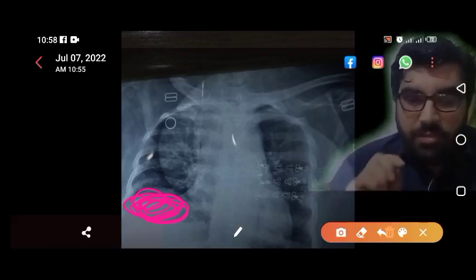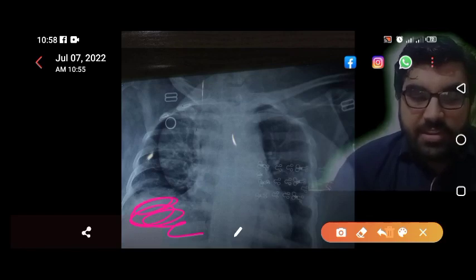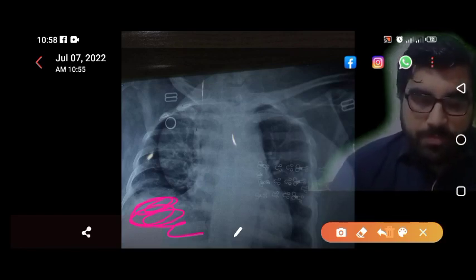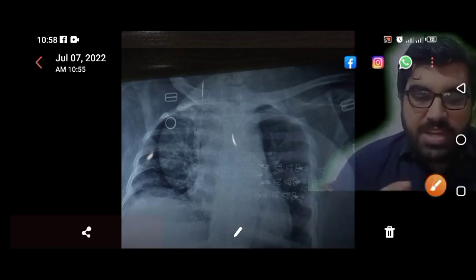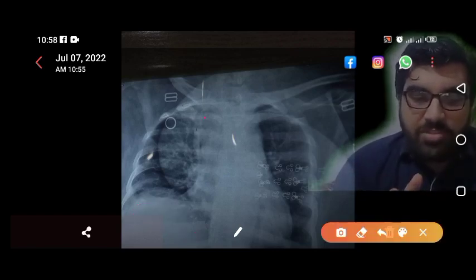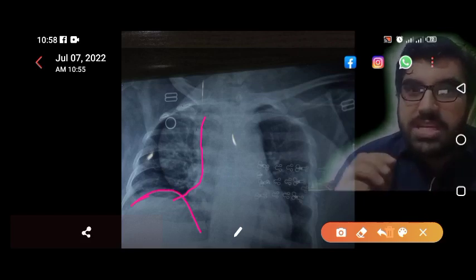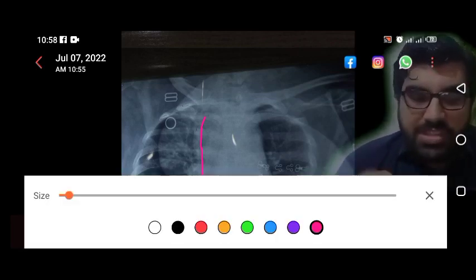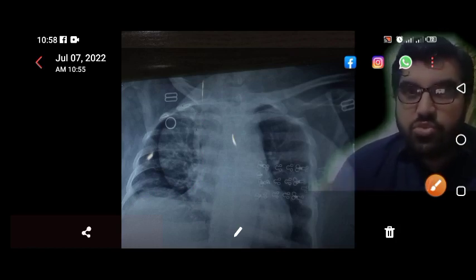The second differential is a liver-related cause — the liver might be enlarged. The third differential is phrenic nerve palsy, which can also give rise to elevation of the right hemi-diaphragm. So what is the best next step?